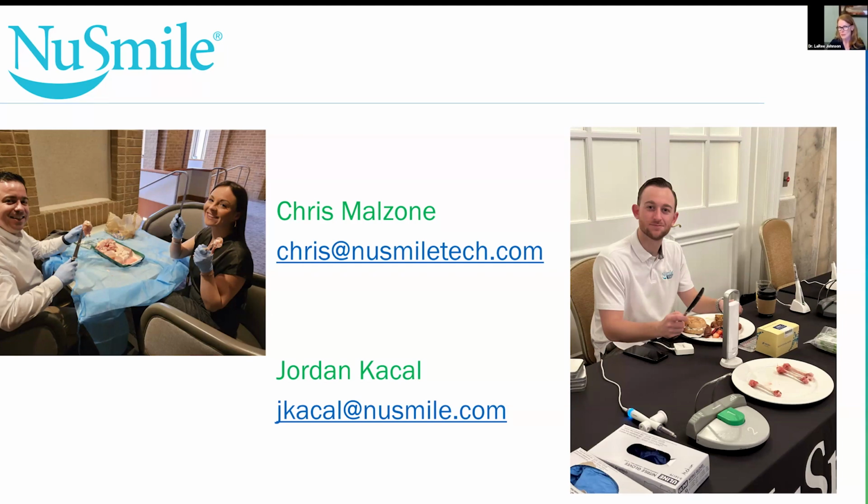Well, two things. I am so glad you brought this up because one of the beautiful things, and I'll get to that question, one of the beautiful things about using intraosseous anesthesia is you have so much better hemostasis from your sockets because you're bathing those sockets in epinephrine, regardless of the concentration. It's so much closer than when you're blocking or infiltrating. It's a beautiful thing. And I find I use so much less gel foam. So I'll just say that. I wish I would have said that earlier. So thanks for triggering that for me.